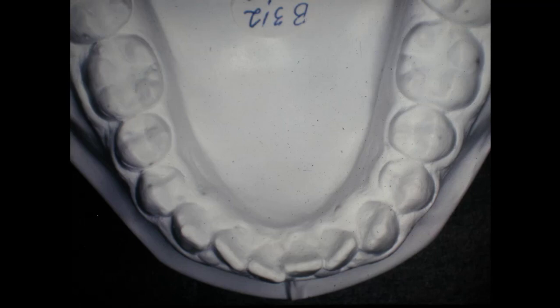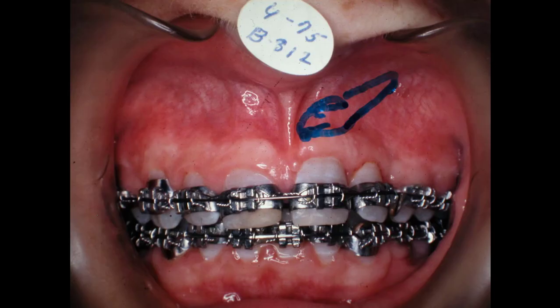Okay, let me go back and see if I know. And on the lower arch, nothing unusual. We just did this, and this was back in the good old days when we had to put bands on everything, and God, that was a touchy job. I tried to push a band on this tooth when I knew the root was just really short up here, and I was really afraid that the tooth would just get knocked out, but it held on pretty good during the treatment, and as far as I know, the young man still has the tooth. I haven't heard any different.